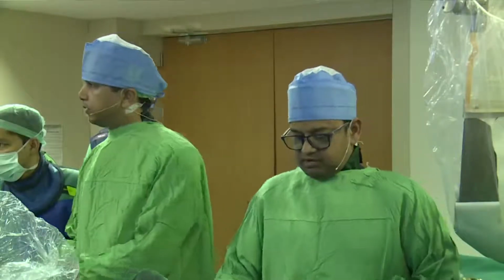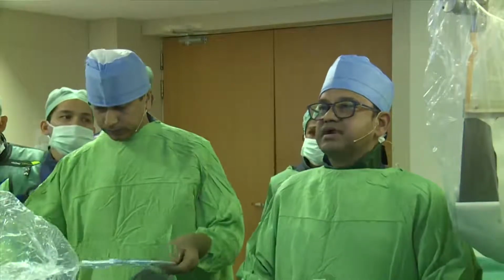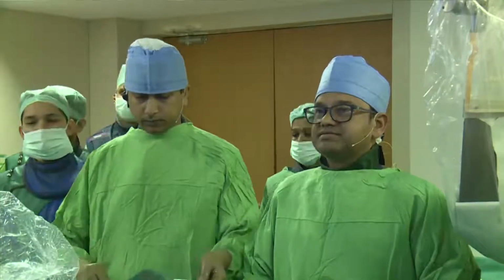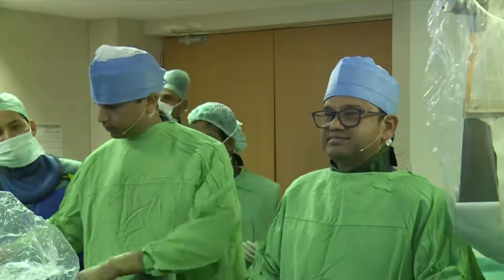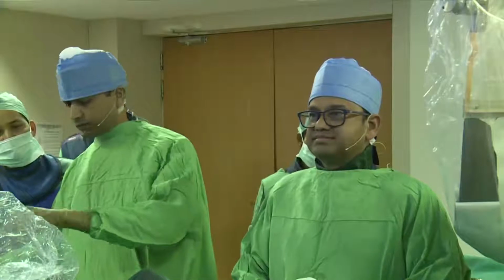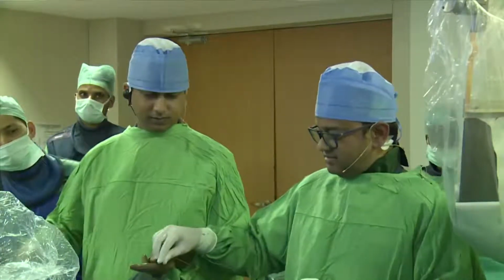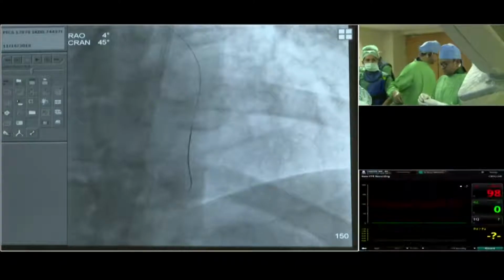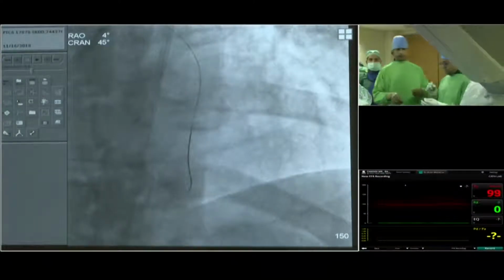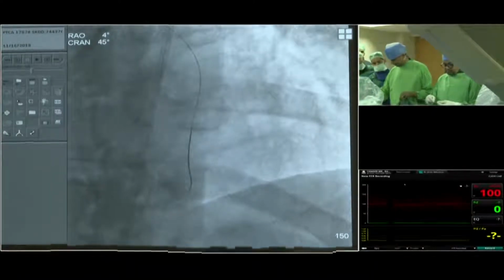So, while we are getting it in, how many of you end up with FFR at the end of all interventions? We don't routinely do it because the results are so dissatisfying. We'd rather not know. Yes. I think we're starting to look at that a little bit more in certain cases, especially when we're surprised about physiologic lesions, especially intermediate disease.